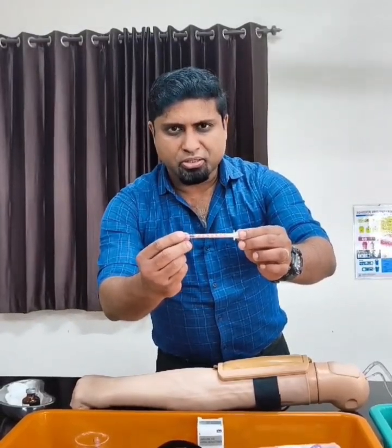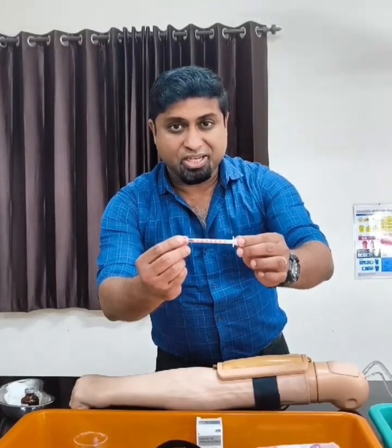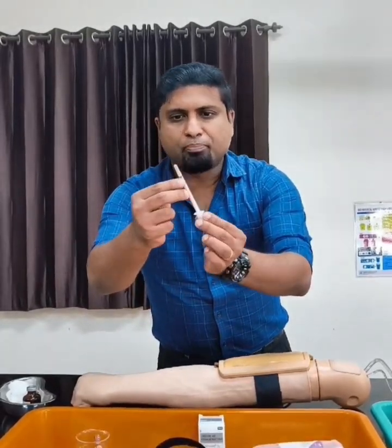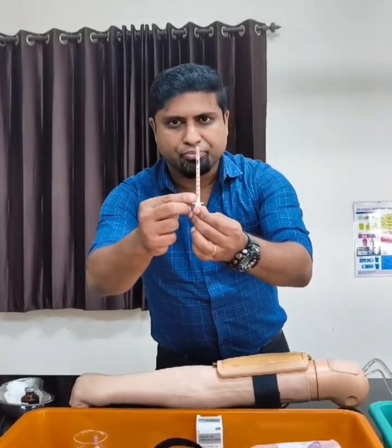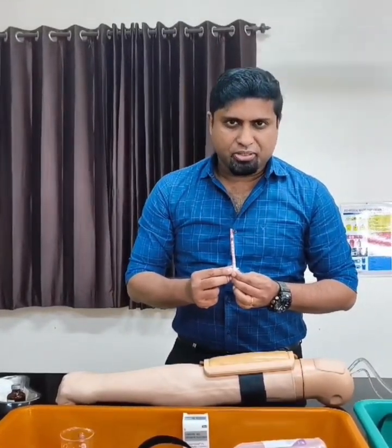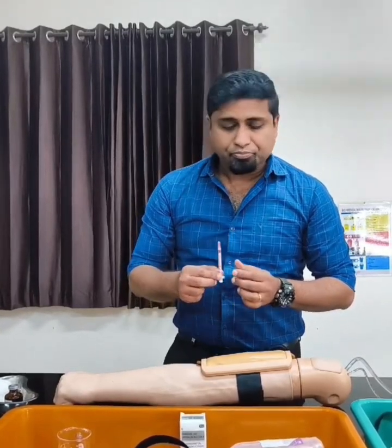But if you take a look at the calibrations, they are not in ml. The calibrations are in units. And if you take a look at the units, it is marked from 0 to 40 in a syringe which can hold up to 1 ml of fluid. Clearly, this is a syringe designed for U40 insulin that contains 40 units of insulin in 1 ml of fluid.